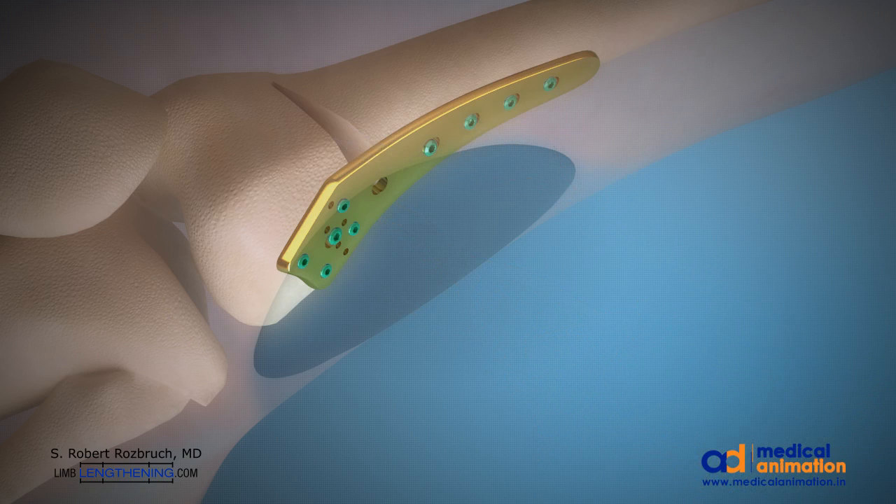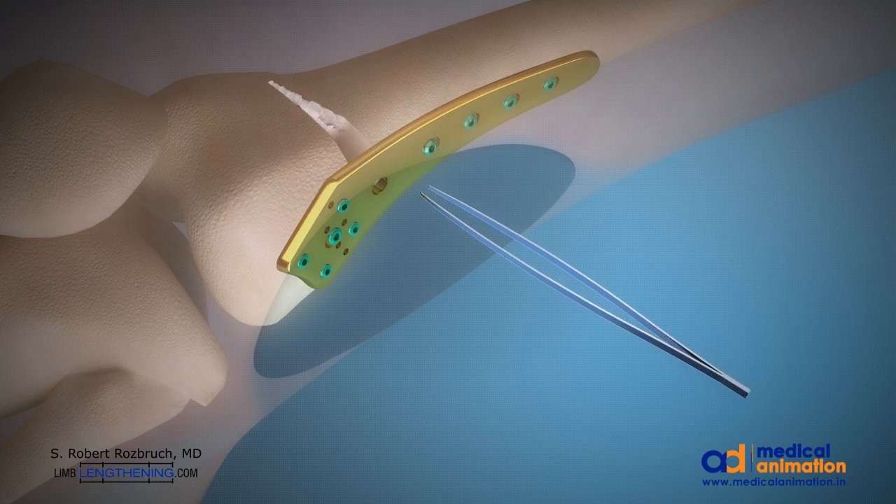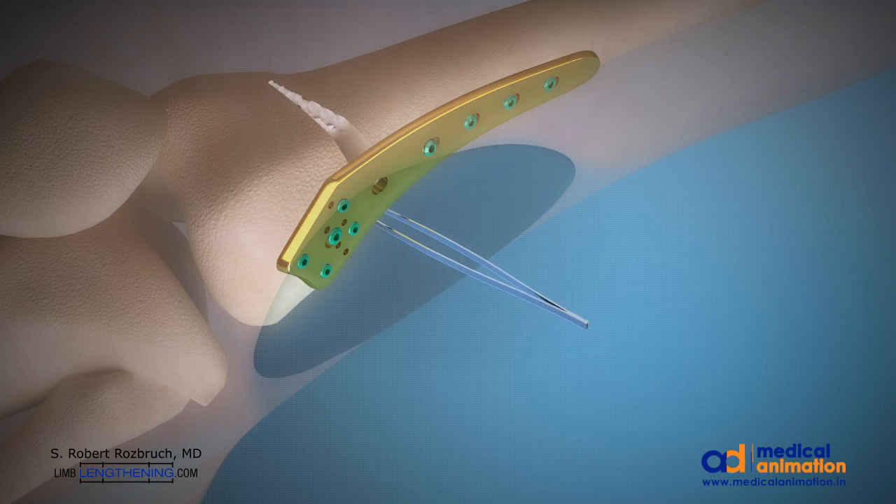The open wedge osteotomy is then filled with a synthetic bone graft. This area has high healing potential, and autograft is not necessary. We're also using tranexamic acid during this surgery to minimize blood loss.